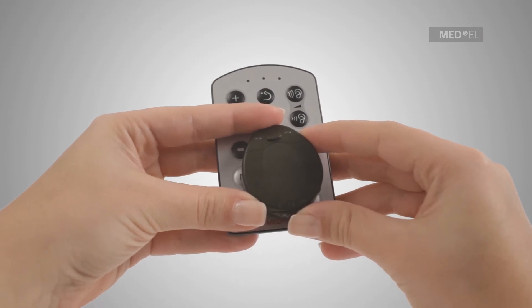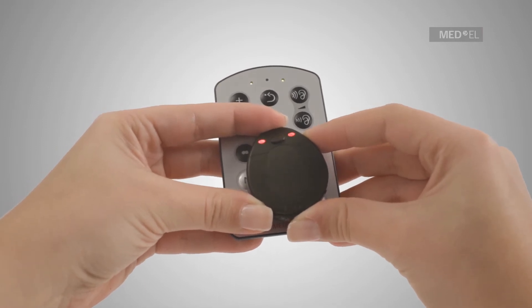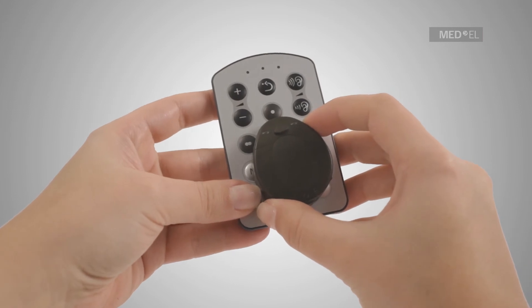Finally, switch the audio processor on. The Rondo and FineTuner will be synced automatically. The amber lights of the FineTuner will blink when successfully synced.